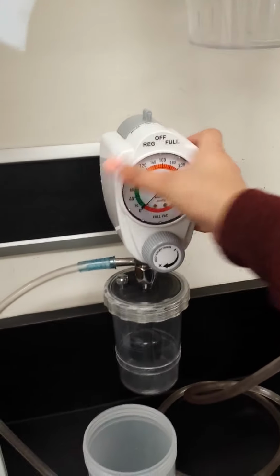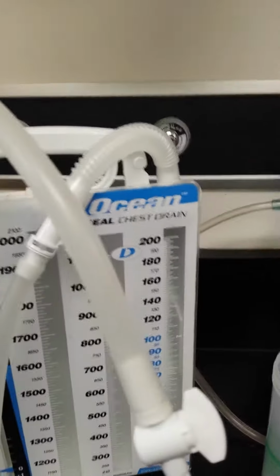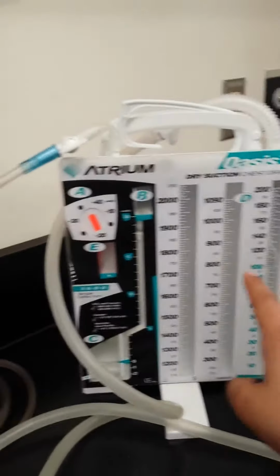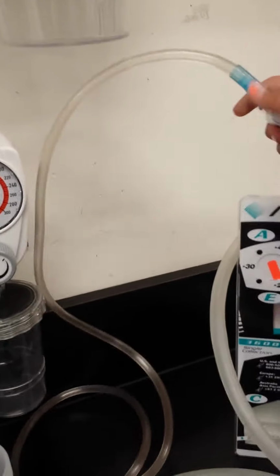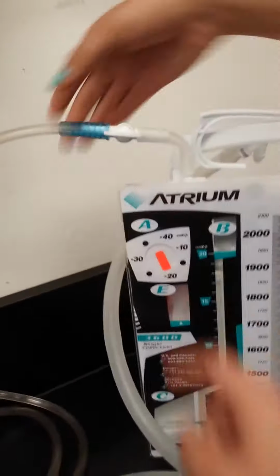So first we attached this thing to the wall, and we put the canister on, and we attached this tubing. It goes all the way around. Oh, okay, we'll do this one first. It's set up in the dry. This one's the dry, so we set it up into this tube. But before we would set it up, we would take this off, so we can take it off.